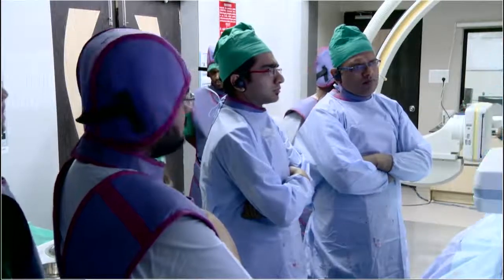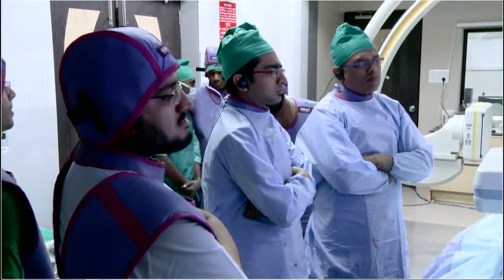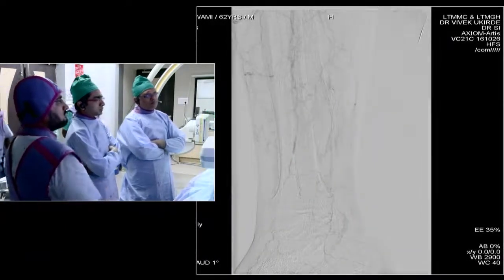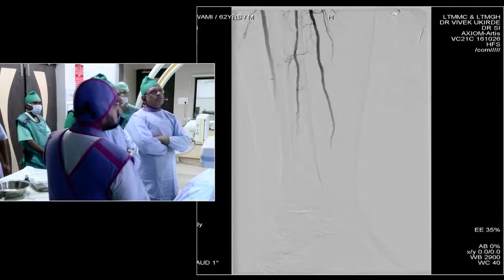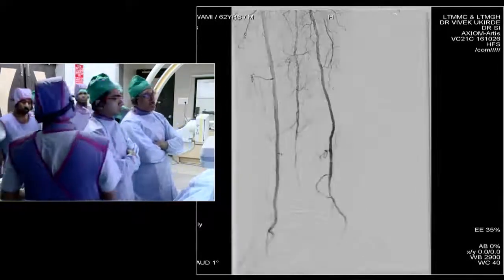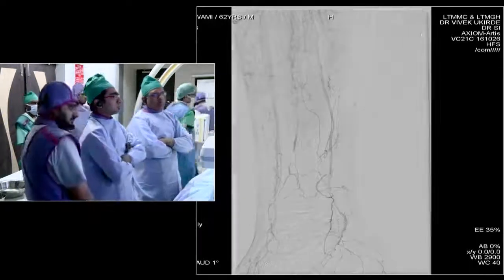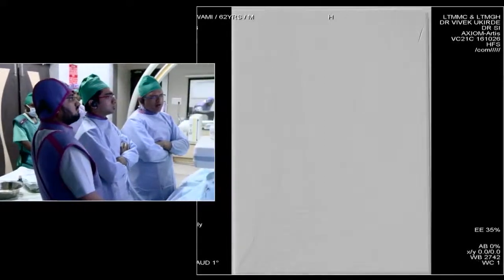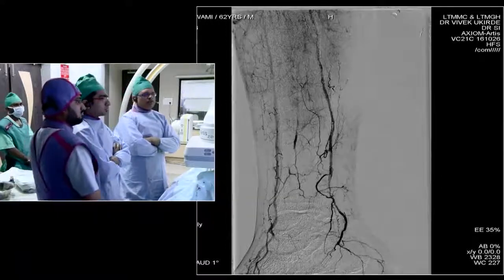The dorsalis pedis artery is occluded and calcified — that is the reason we did not go into the anterior tibial artery; you can just see the collaterals there. While deciding the approach, the anterior tibial artery was better than the posterior tibial up to the ankle. So we decided to treat the posterior tibial artery to increase the pulse pressure distally and give a chance for collaterals to form.